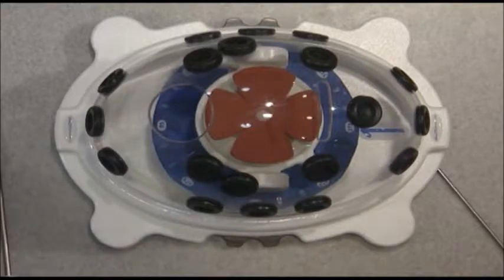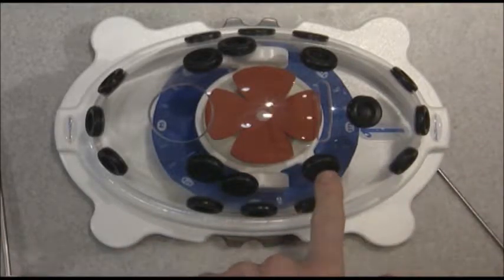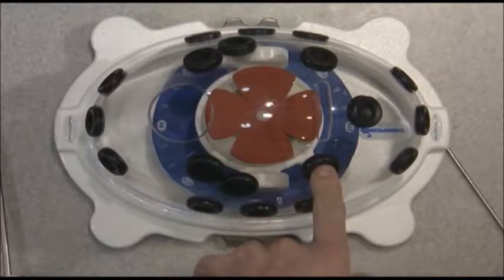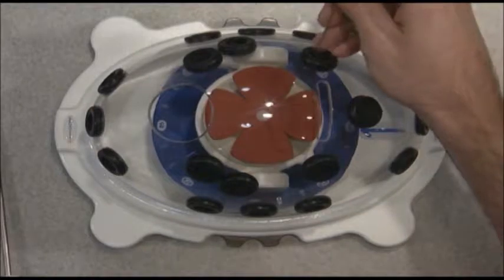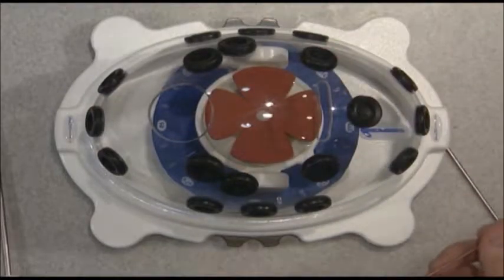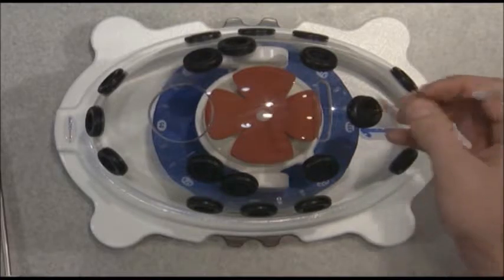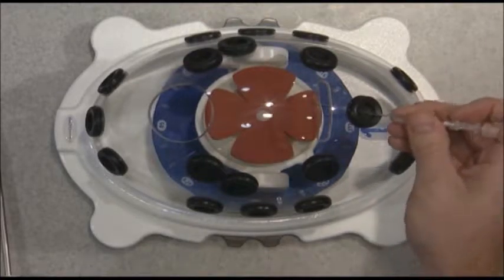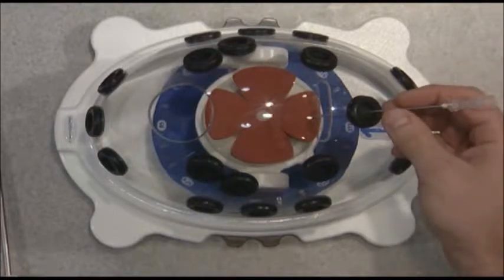The first thing that we're going to do is I'm orienting myself here that this is a posterior portal, this is a lateral working portal, and this is an anterior portal. So I'll be referencing them throughout this demonstration. So we're going to work through this lateral portal. This is going to be our lateral edge. You can imagine that this would be like the supraspinatus tendon of the rotator cuff.